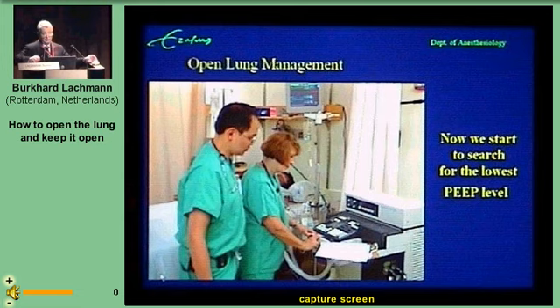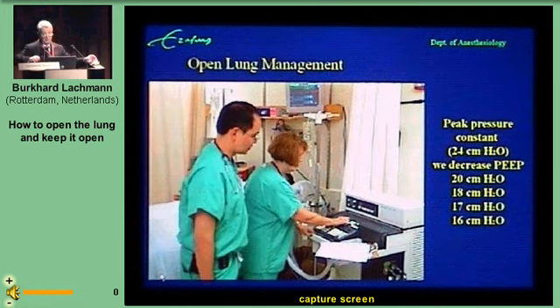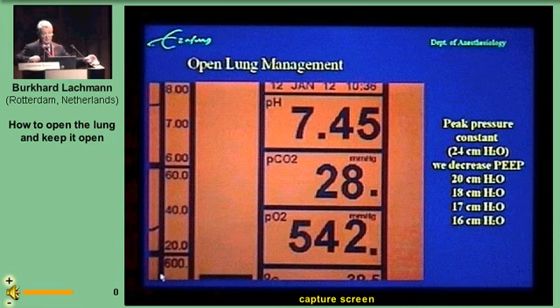Please decrease the PEEP, which should be still 20, to 18 centimeters of water, but keep the peak pressure at 24 centimeters of water. Okay, we're dropping PEEP to 18. What is the PO2 doing? The PO2 is unchanged. Wonderful.